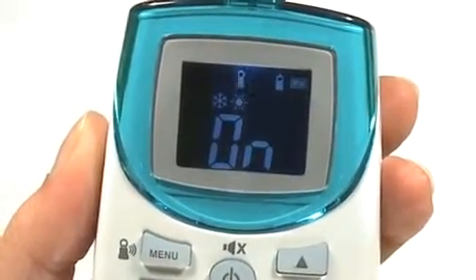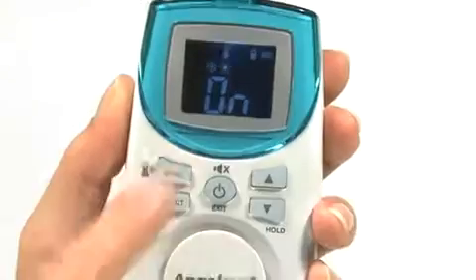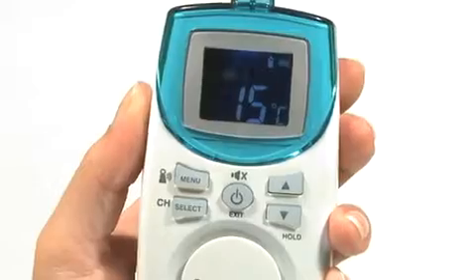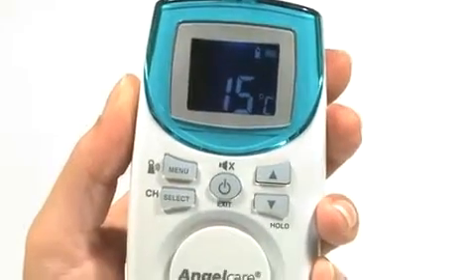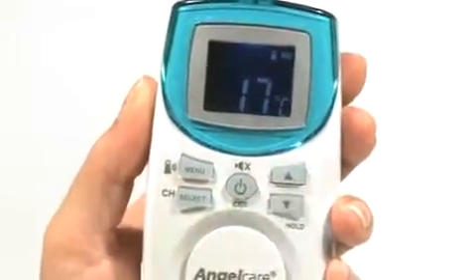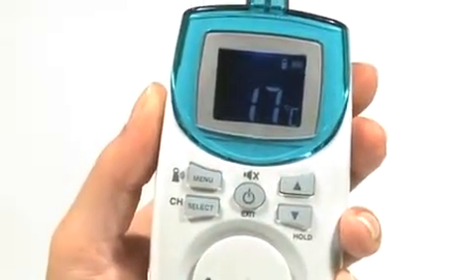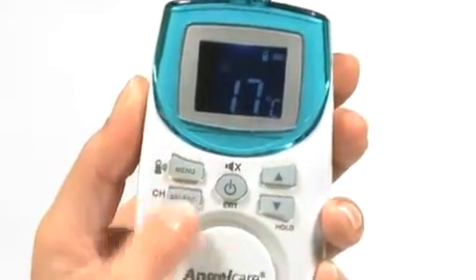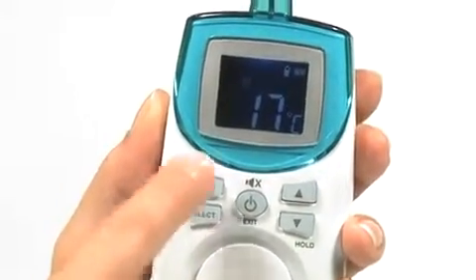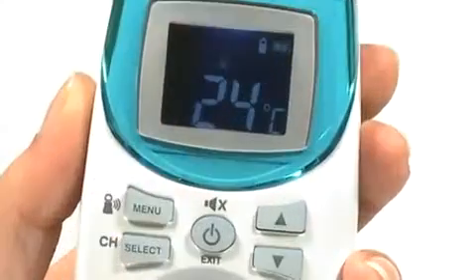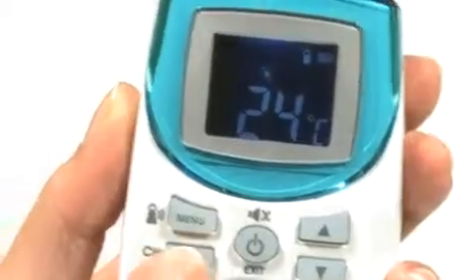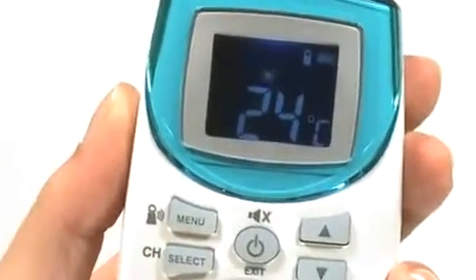To program temperature settings, press Menu so the snowflake icon is flashing. Using the arrows, choose your preferred lowest temperature. Press Select and then Menu. Next, choose your preferred highest temperature and press Select.